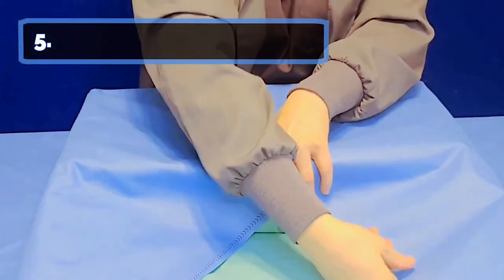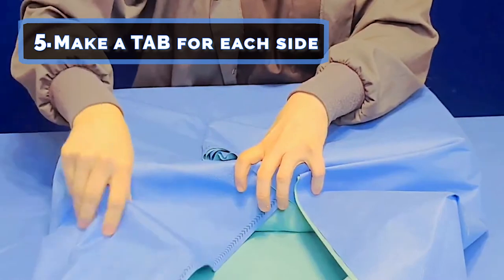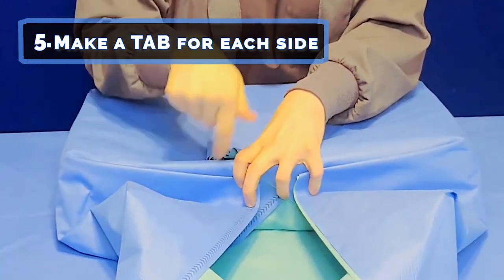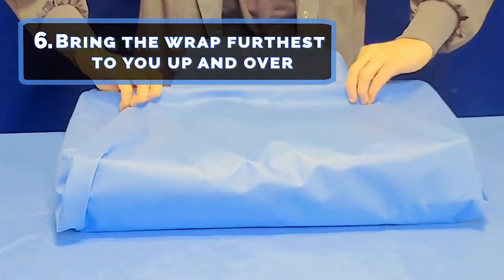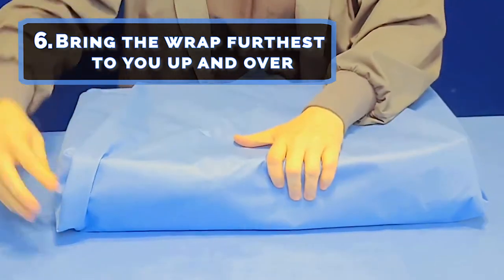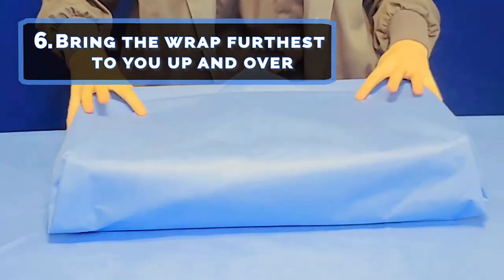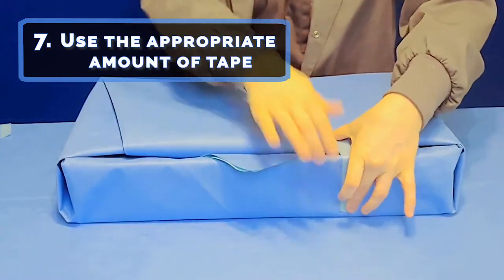5. Make a tab for each one. Refrain from using tape as it is an external indicator. 6. Finally, bring the wrap furthest from you up and over towards you and tuck, leaving a pull tab. 7. Use the appropriate amount of tape. No need to get crazy.